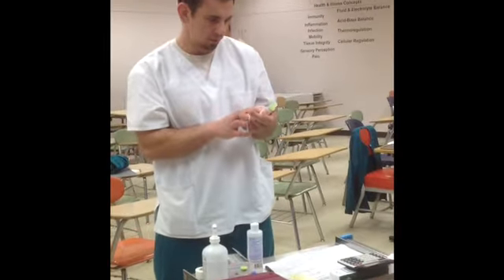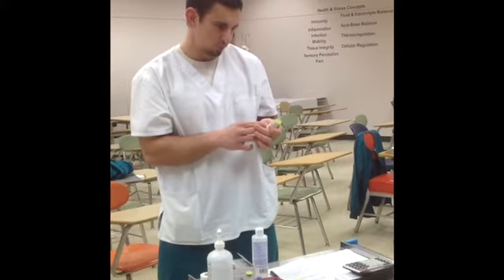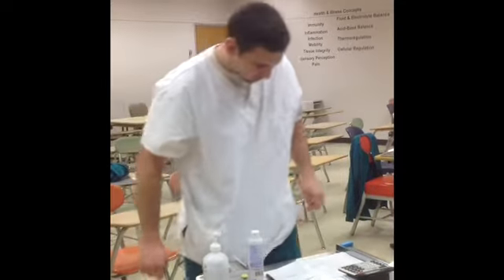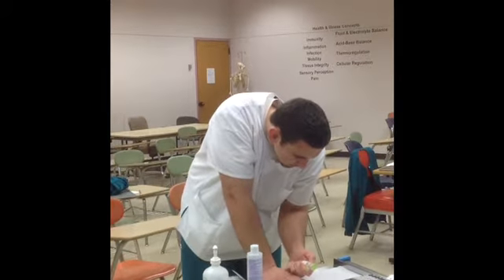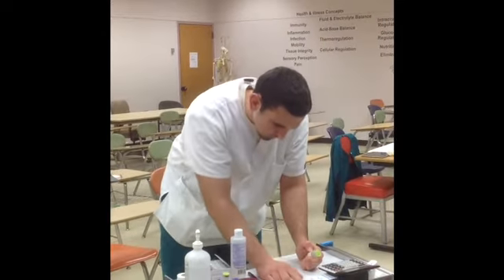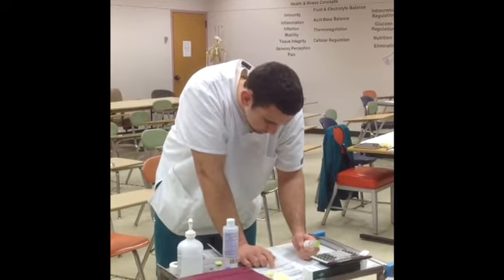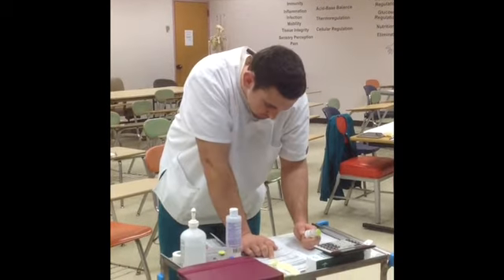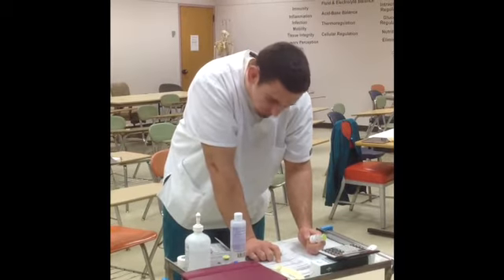So to calculate, I have to get it into volume, which is mLs. And that'll come out to 1.2 mLs of Bacillin. Alright, so I'm going to compare the drug to the MAR and the order form. So let's see, Bacillin, and the patient is Charles Kamang. Okay, the right dose, 2.4 mLs, 2.4, I mean not 2.4 mLs, 2.4 million units.